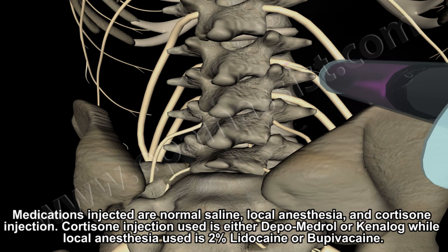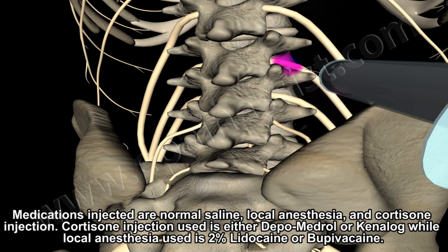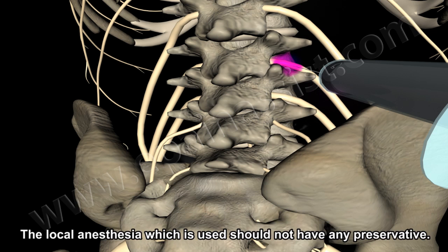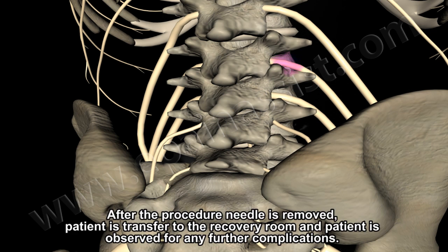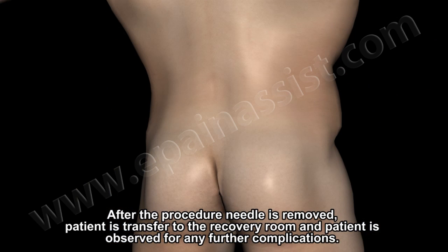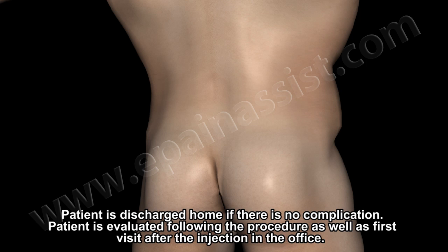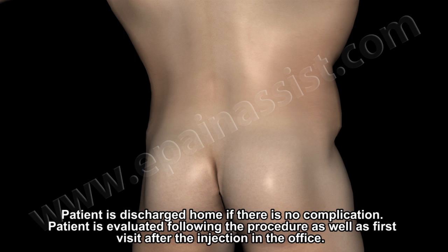The cortisone injection used is either Depo-Medrol or Kenalog. The local anesthesia used is 2% lidocaine or bupivacaine, and it should not contain any preservative. After the procedure, the needle is removed, the patient is transferred to the recovery room, and observed for any complications. The patient is discharged home if there are no complications, and is evaluated at a follow-up office visit after the injection.